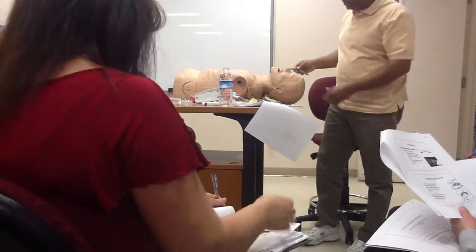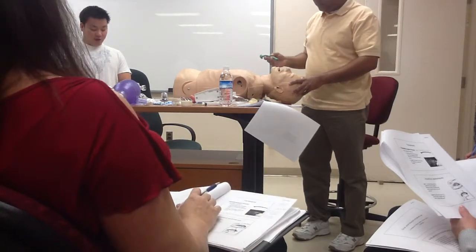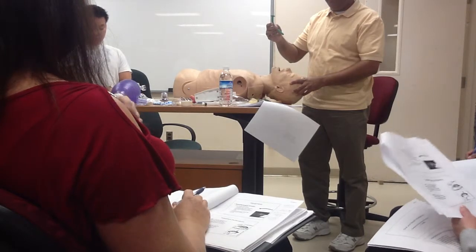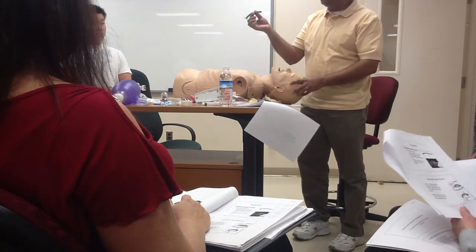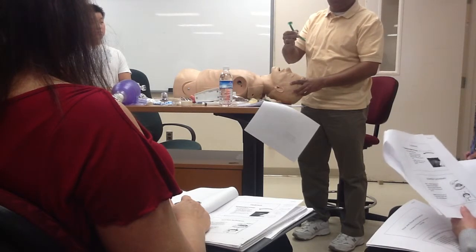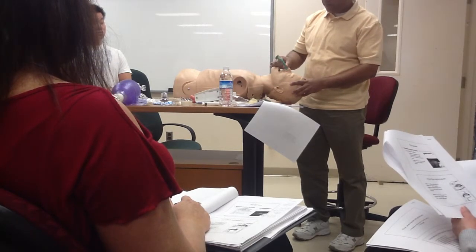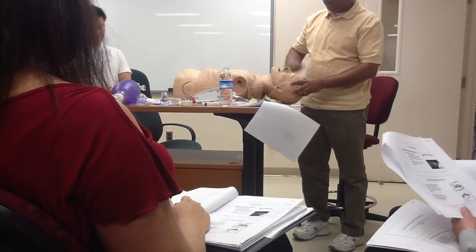All right, now, how do you put this guy in? That's the question. What position should the patient be in? Sitting. Do I need to turn this upside down like I did on the other one? You have to put the tip towards the nose, following the natural curve. But when you do the checkoff, if you put it in like this, you fail the checkoff. So natural curve. You're supposed to put the bevel against the septum and then rotate as you go.